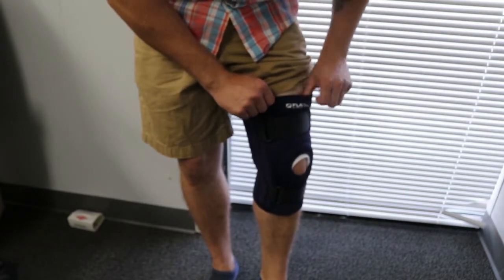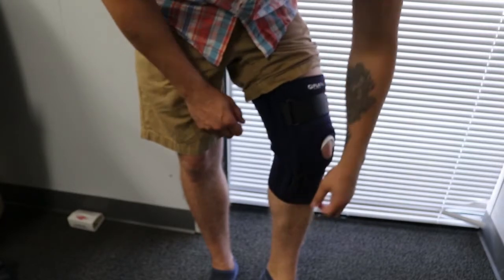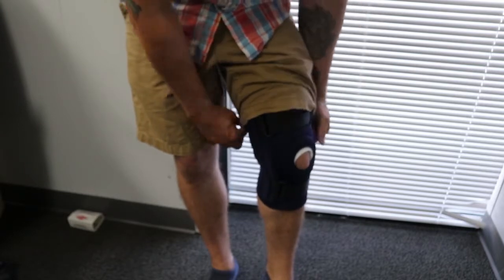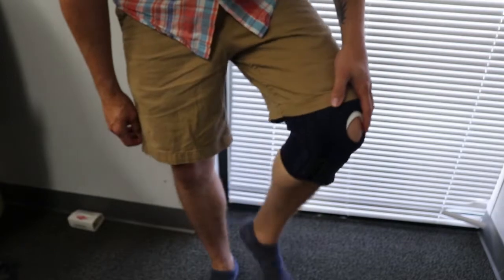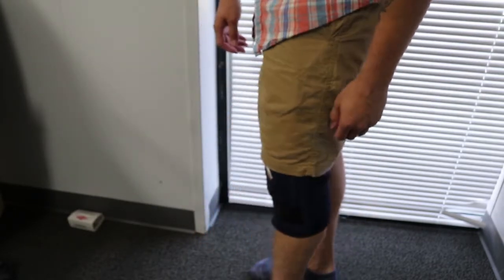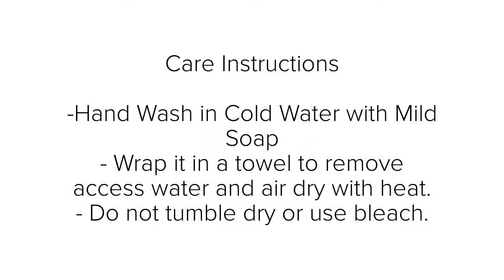Be careful when adjusting the straps not to over-tighten and inhibit circulation. When you put the brace on before addressing the straps, it should fit snug, but you should still be able to fit a finger or two between the brace and your leg. You do not want the brace to be too loose, as it won't provide the support you need, but at the same time you don't want it too tight to inhibit circulation.